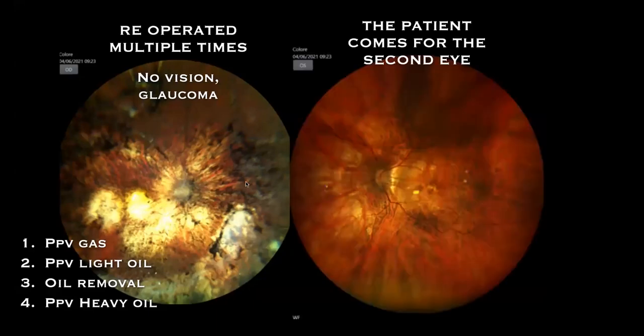First, it was operated with a vitrectomy and gas, but then she had a relapse. It was originally a stage 3A. So the macula redetached and she was operated with vitrectomy and oil, and then silicone oil removal, and then heavy silicone oil. So this is an example of how an eye can end with no vision and glaucoma.